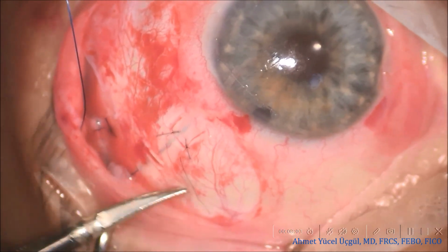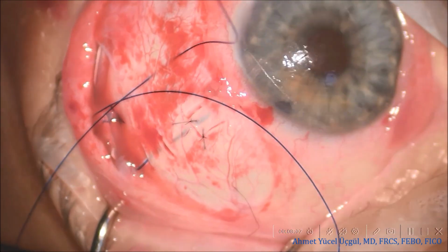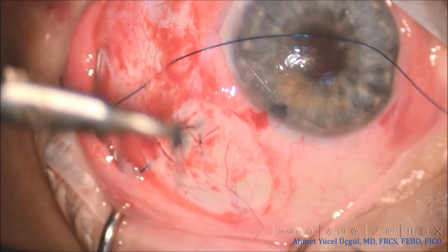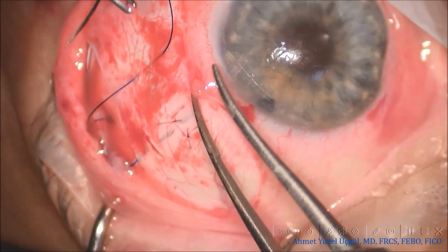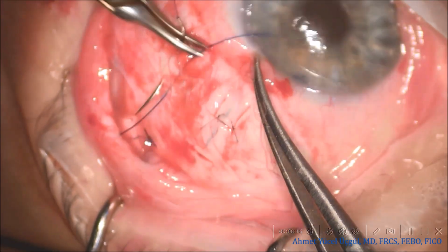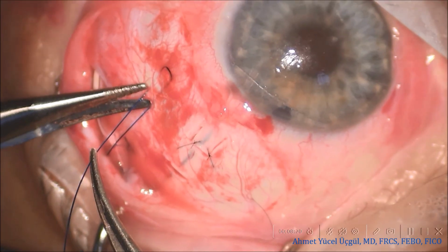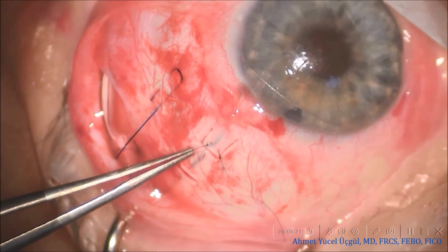The external end of the ripcord suture is then passed through the sclera using a Z-suture technique. The suture is cut at the scleral exit point, and a small loop is left near the limbus. This configuration serves two important purposes. First, it prevents the Prolene end from eroding through the conjunctiva, and second, if intraocular pressure rises later in the postoperative period, the ripcord can be easily removed by simply grasping this limbal loop.